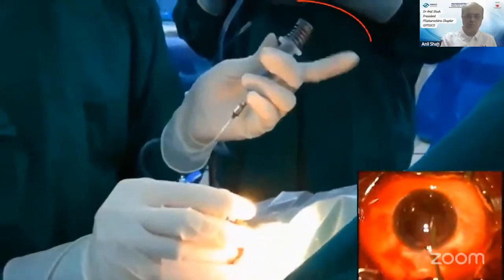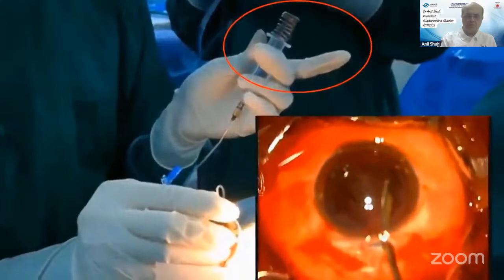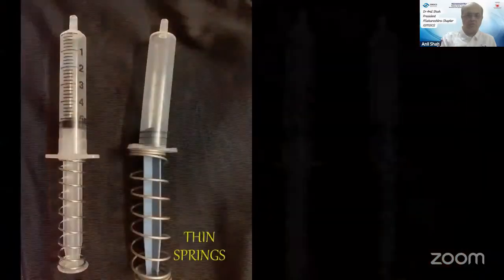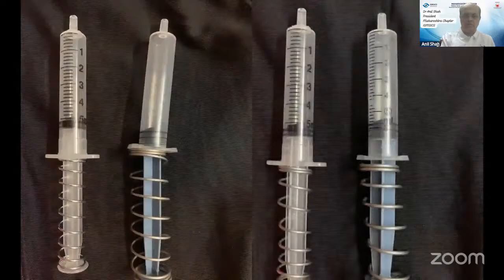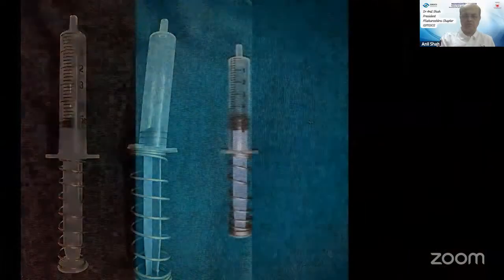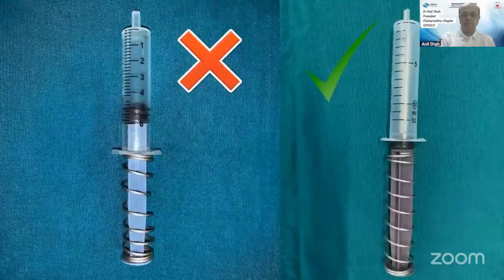Unfortunately, to our disappointment, the reality while using a thin coiled spring on a 5cc syringe inside the eye's anterior chamber did not meet our expectations. However, with persistence and determination, we tried with a range of springs of varying coil thickness and varying number of coils. Eventually, when inadequate volume was the only concern, we jumped in and started trials with a 10cc syringe.